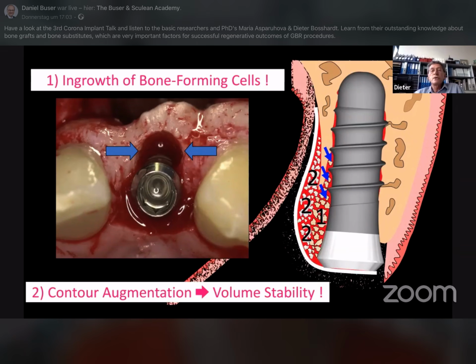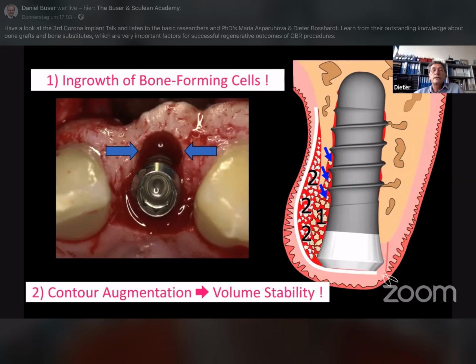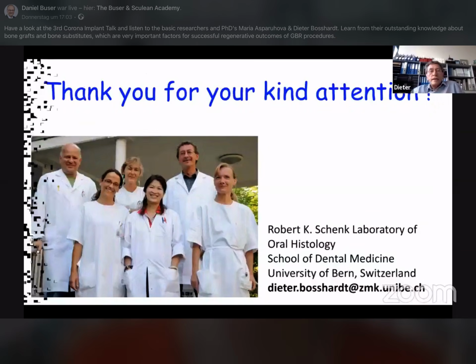It's covered then with a barrier membrane here. The flap is closed, and all you have to do then is to wait and to give the tissues really enough time for healing. And this really takes time if bone is involved. So thank you very much.